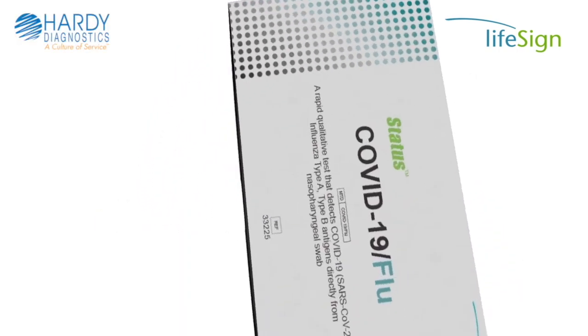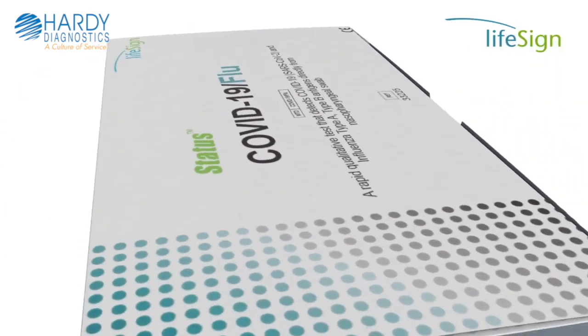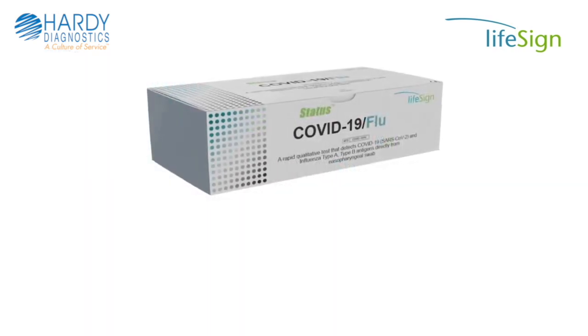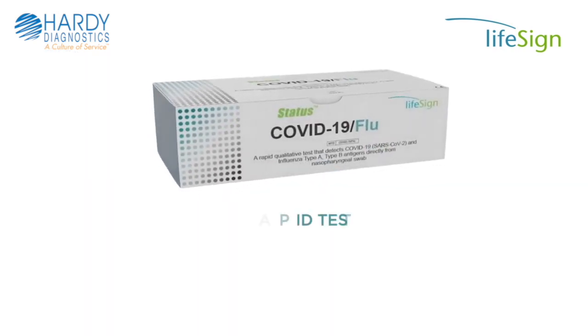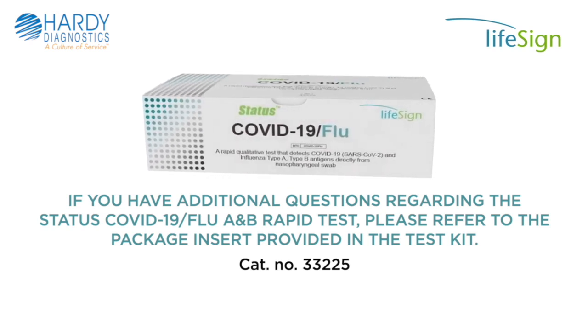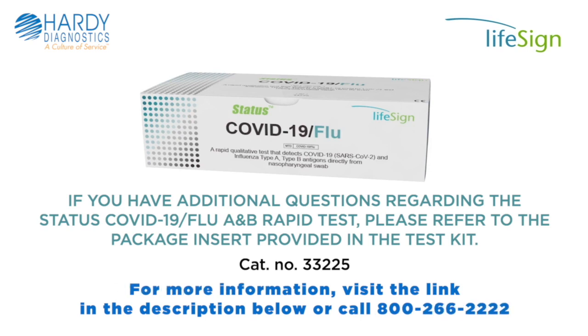Once the test is completed and patient results have been reported, dispose of all testing materials used in the appropriate waste container according to your state and local biohazard waste disposal guidelines. If you have additional questions regarding the Status COVID-19 Flu A&B Rapid Test, please refer to the package insert provided in the test kit.